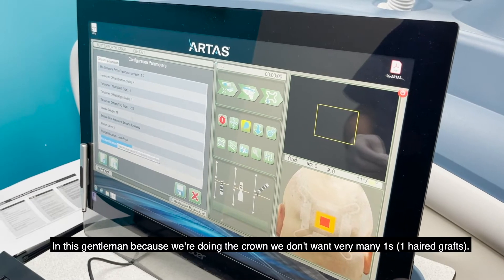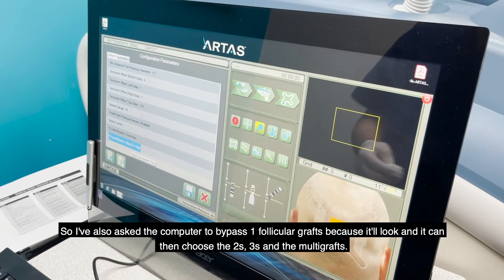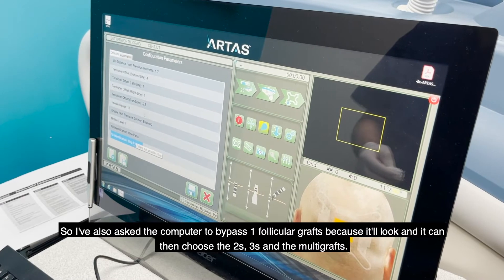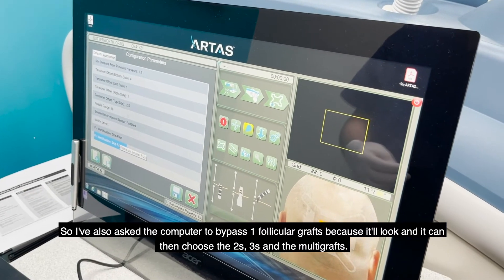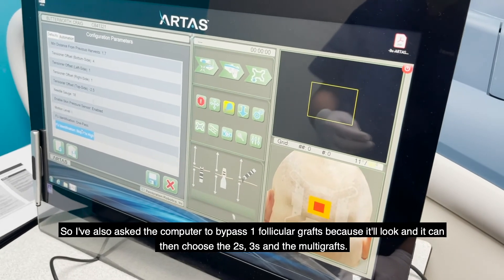In this gentleman, because we're doing the crown, we don't want very many ones, so I've also asked the computer to bypass one follicular graft. It'll look and it can then choose the twos and the threes — the multi-grafts.